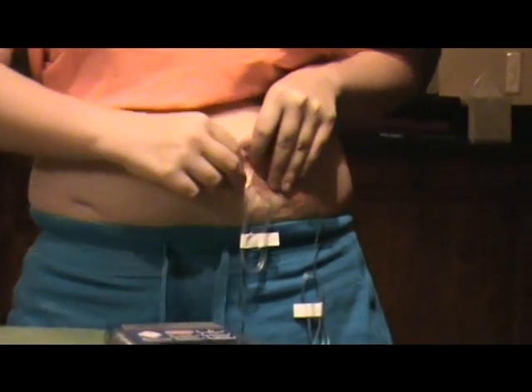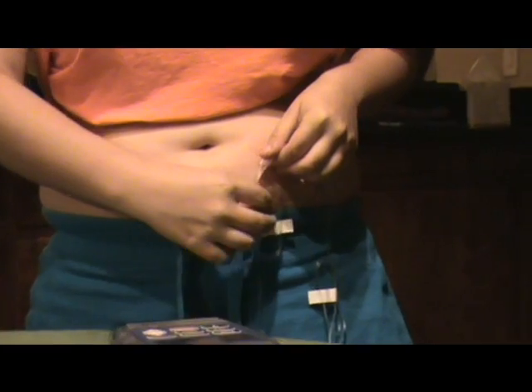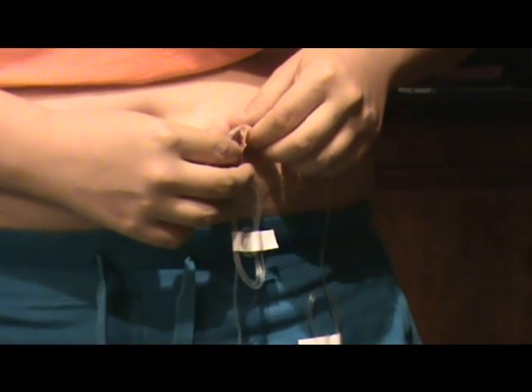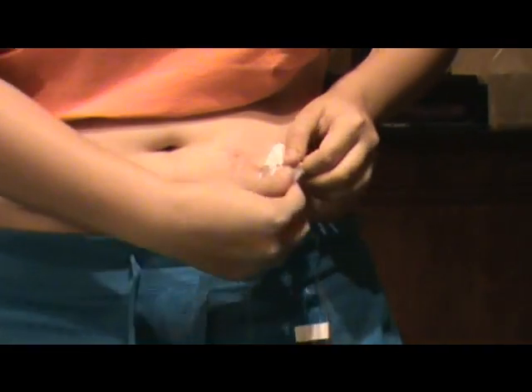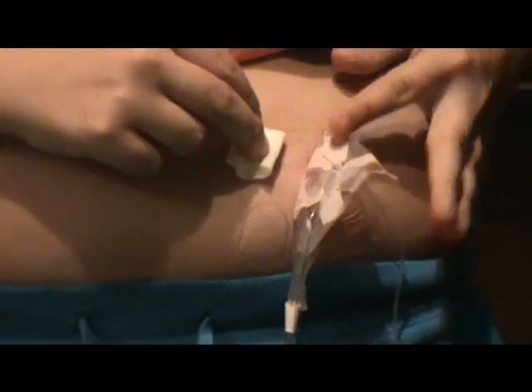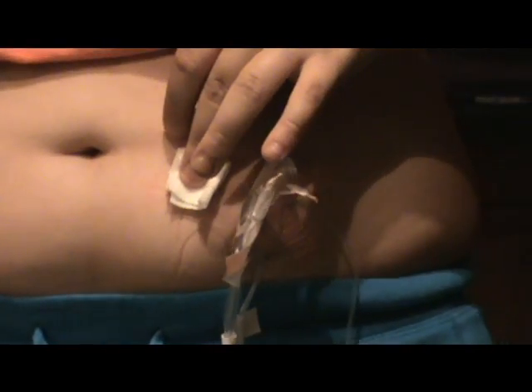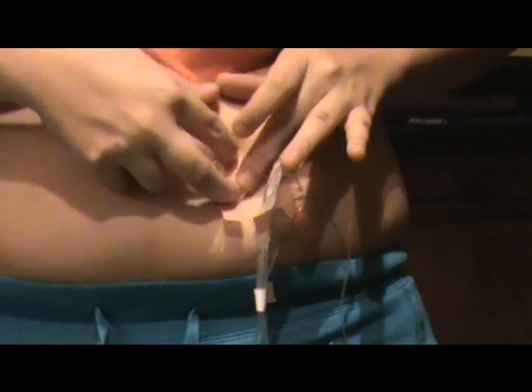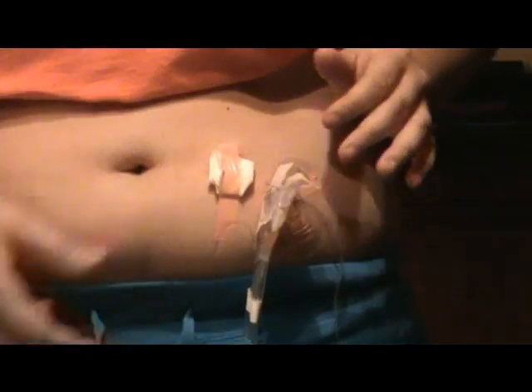You want to take these out both at the same time. And you just want to pull back the tape slowly. Just want to use the oil. Sometimes some of the fluid will come back out, so you just want to have the band-aid or something ready. But it looks fine today. And then I just take a little piece of tape.